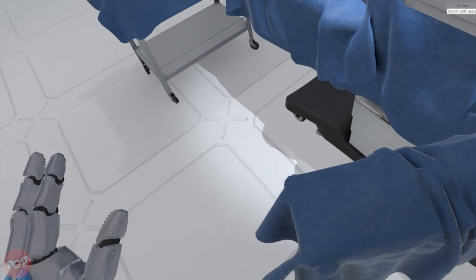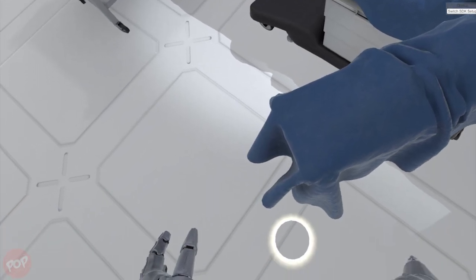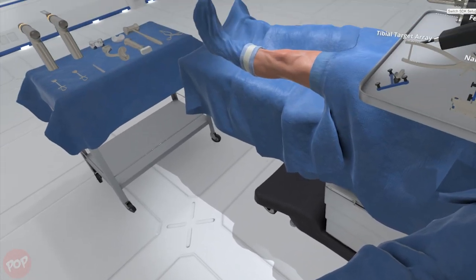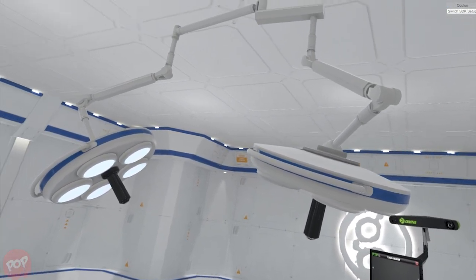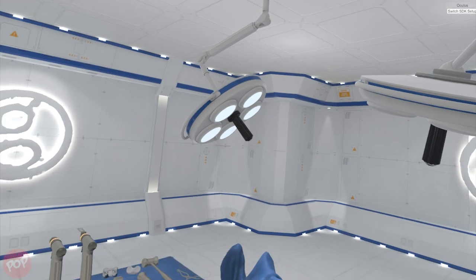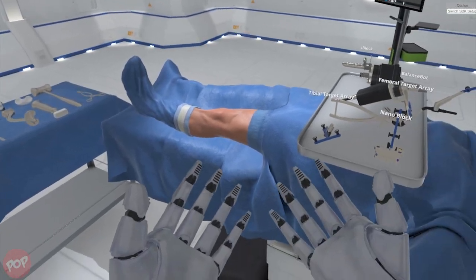Welcome to Wraith Virtual Medical Training Simulator. In this simulation we will be performing a total knee replacement surgery.